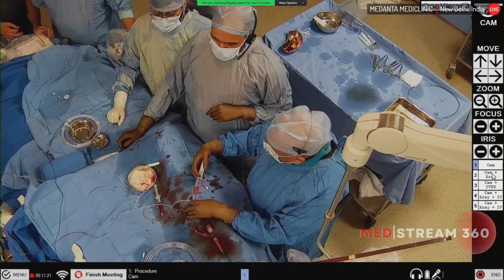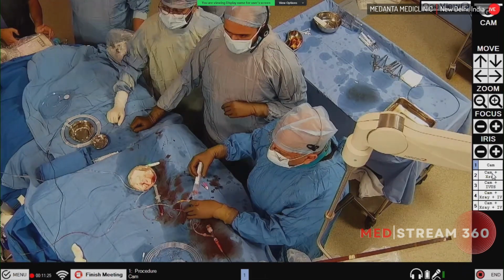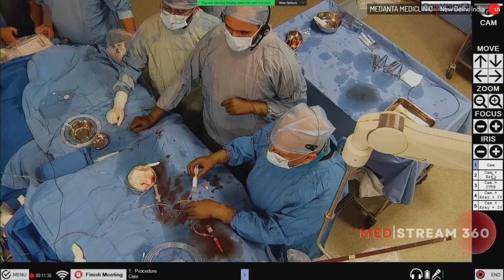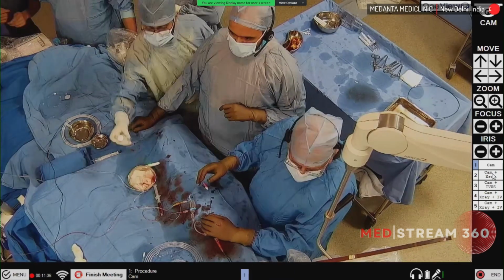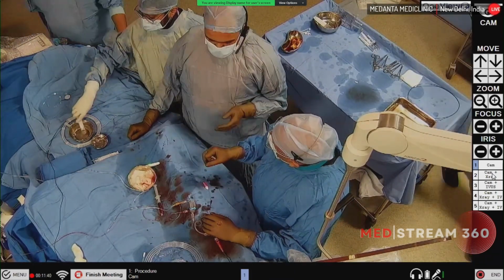He underwent coronary angiography, which revealed the left main was plaquish, and the LAD also had some borderline lesion, and the circ was totally occluded, and the ramus also has some tight lesion around 70. The RCA is also occluded, around 100% at the origin. So Dr. Chandra will now tell the treatment strategy, the plan for this patient.